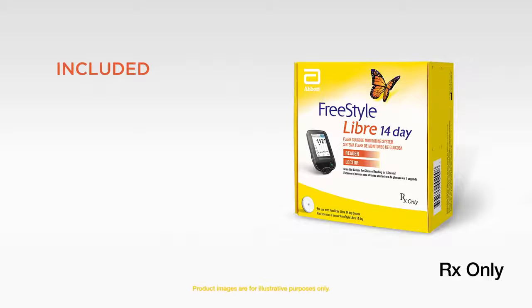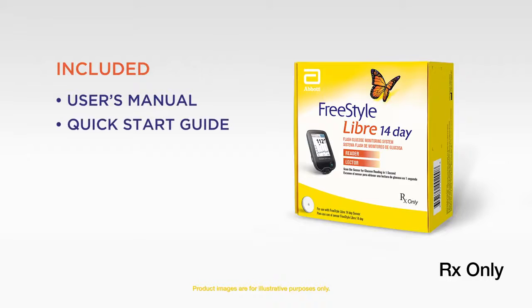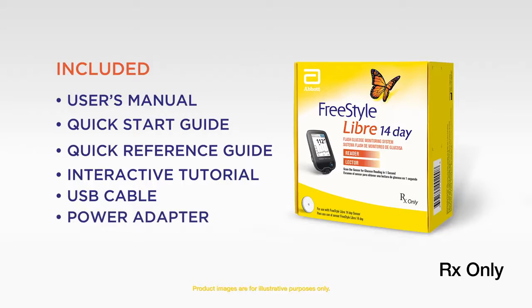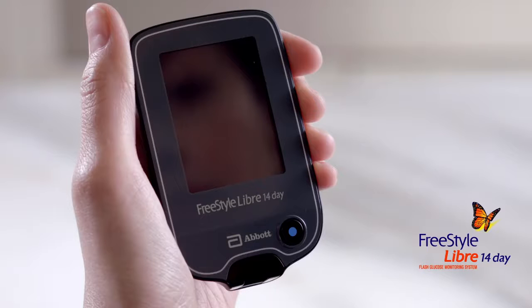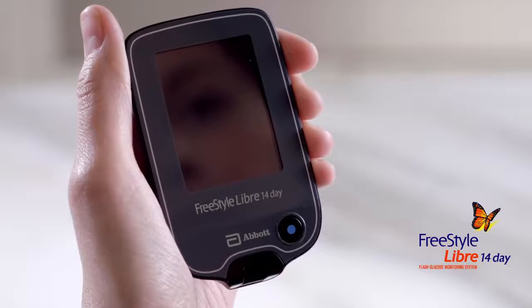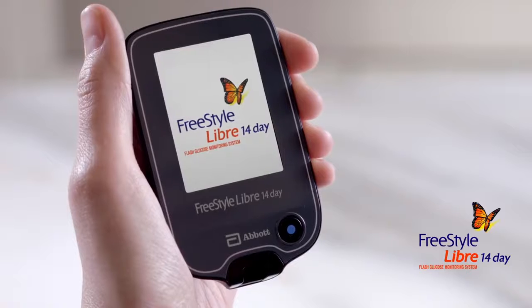When you open your new FreeStyle Libre 14-day reader kit, you'll find the user's manual, quick start guide, quick reference guide, and an interactive tutorial. The reader comes with a USB cable and power adapter. First, take the reader out of the box. The unit comes already charged. Then press the blue Home button to turn on your reader. It's the only button. All other actions are done on the touchscreen.